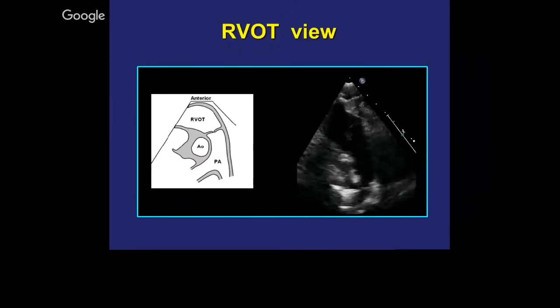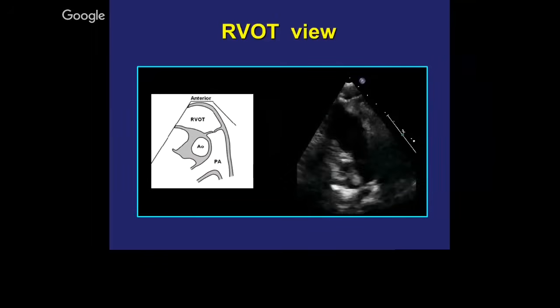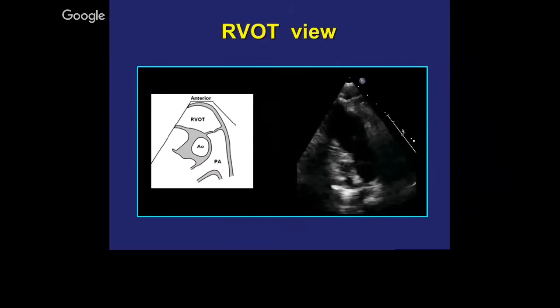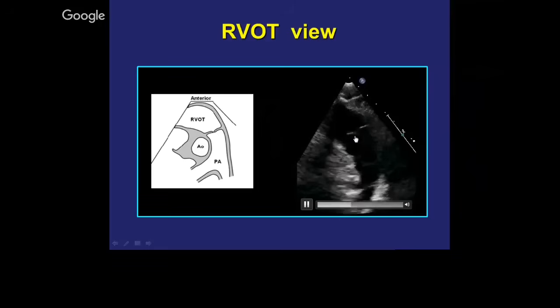Here will be the pulmonary valve at the RVOT. You can see it flicking in and out there right in the middle — pulmonary valve right there. And you can see the right pulmonary artery and the left pulmonary artery as it bifurcates.